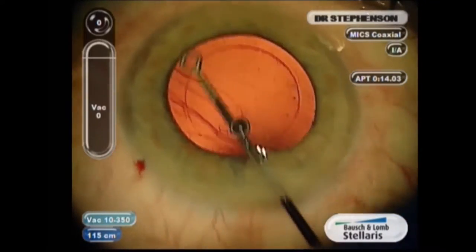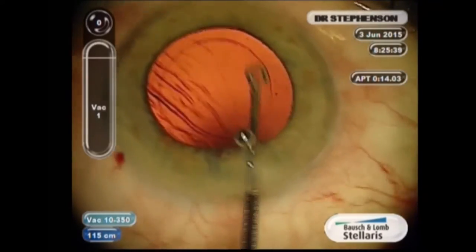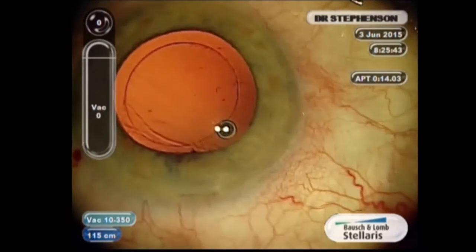So for me, it was kind of my go-to lens for many, many years because it's easy to inject. It opens quickly. It's very stable in the eye, has an aspheric optic.